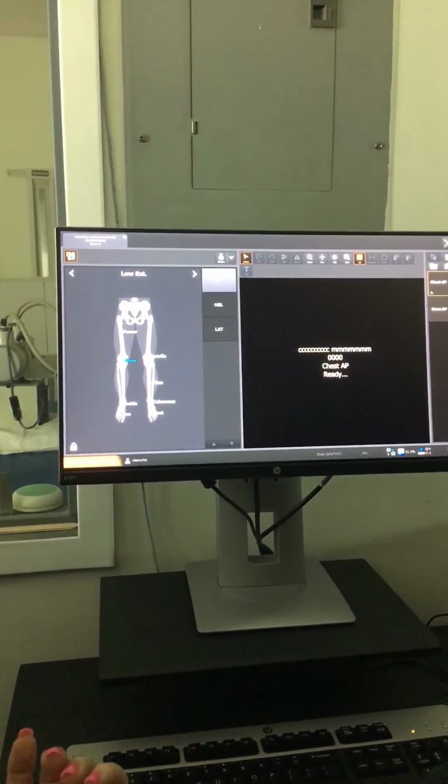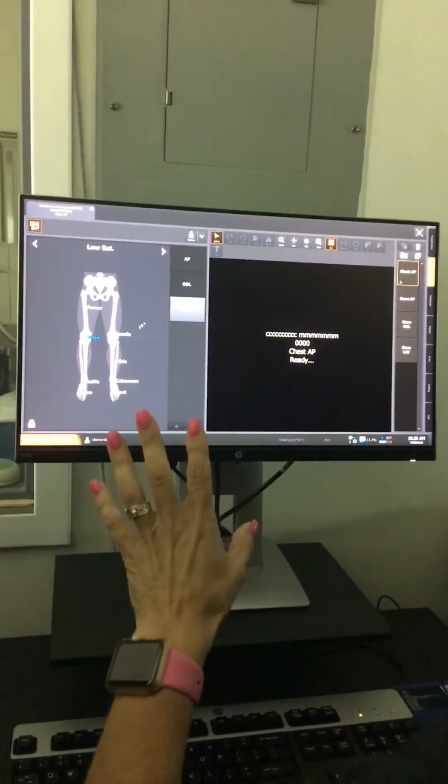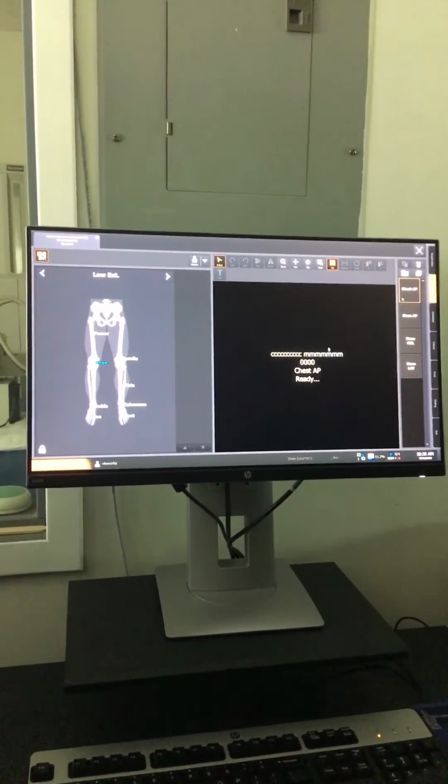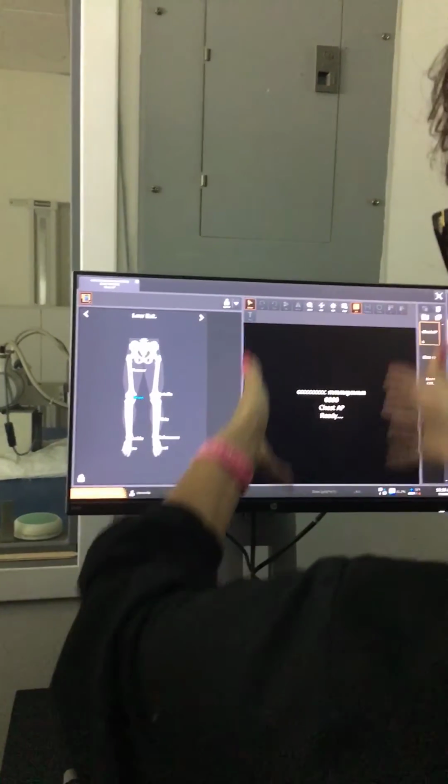Like you wanted on the AP computer at Memorial when he was going over there picking, and then he was like, wait, you're not on the right thing. Okay. And so once you have it, you make sure that one's highlighted. Then you would set up that and have this on. And when you shoot, it comes up right here.